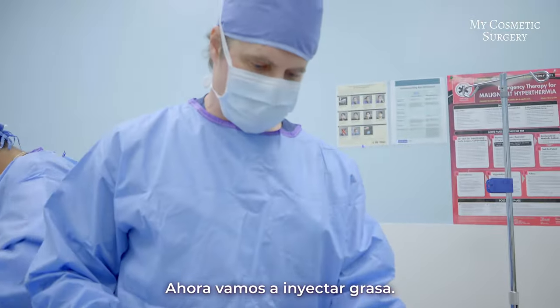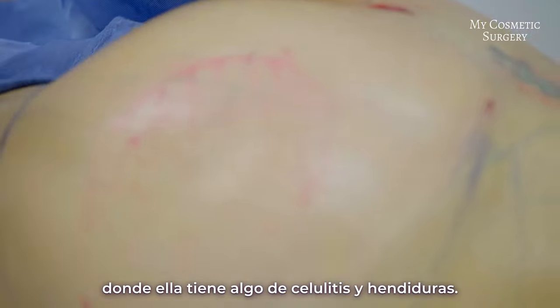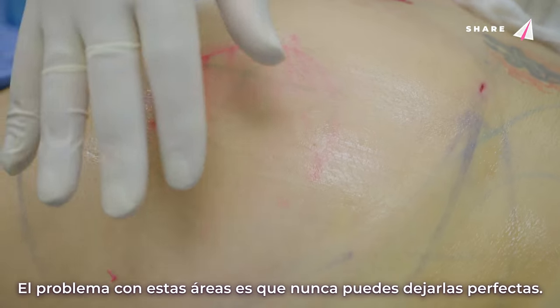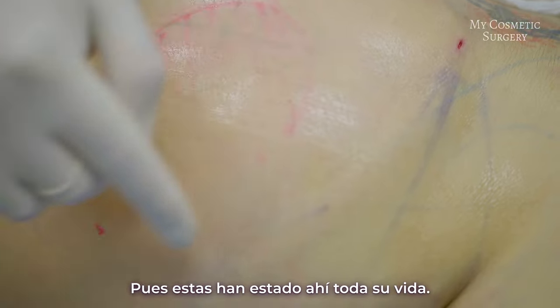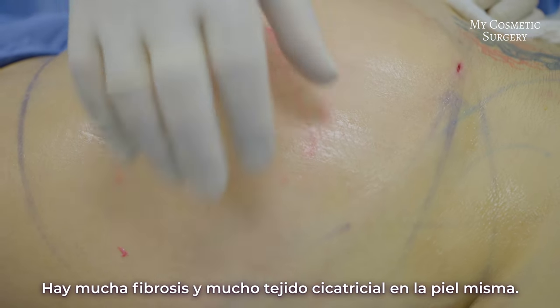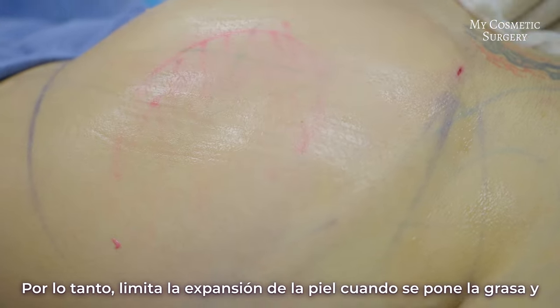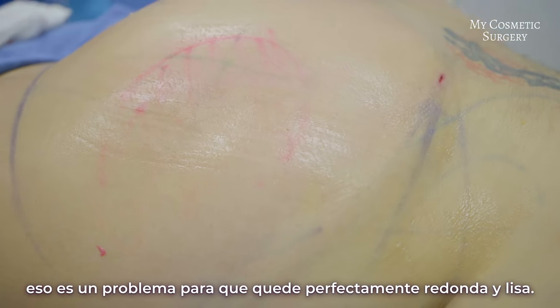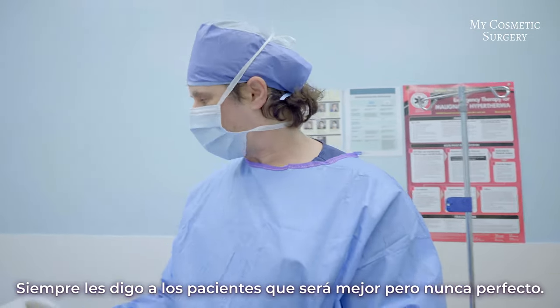Now we're going to inject some fat. You can see the red area circled — that's where she has some cellulite and indentations. The problem with these areas is you can never get them perfect. These have been there her entire life; there's a lot of fibrosis and scar tissue in the skin itself, which limits the expansion when putting fat in. I always tell patients they're always better, but never perfect.